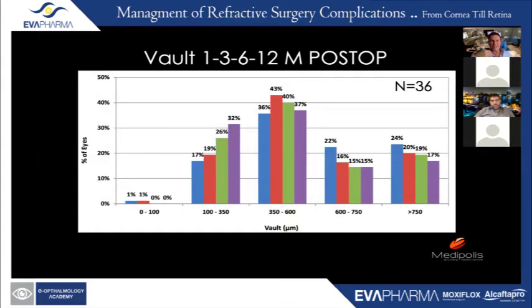We don't get cataract formation, and this is one of the points I'm going to discuss later on. So don't be afraid of low vault. The only issue with the V4C and later versions like the V5 is higher vault and the possibility of angle closure glaucoma, which of course we need to avoid.